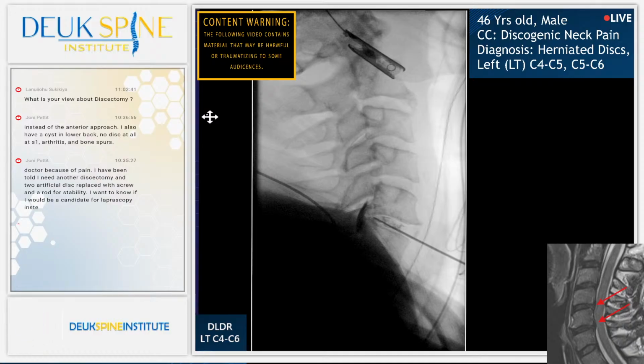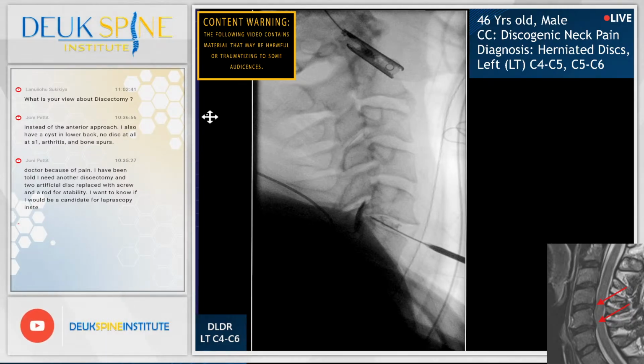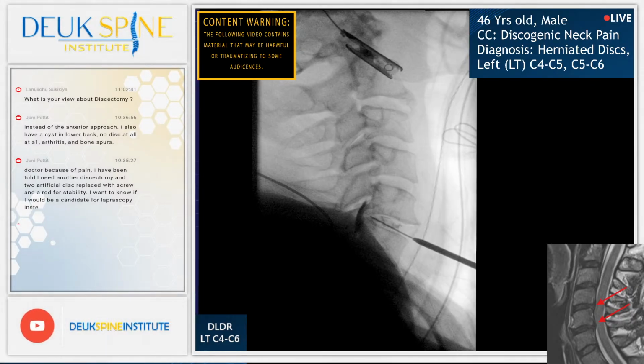The entire surgery is done with a 4 millimeter tube that we use an endoscope to go inside the disc. Shot. I'm going to advance the dilator. I'm going to use the X-ray to guide the advancement. Got to watch the guide wire, make sure it doesn't go in any further.